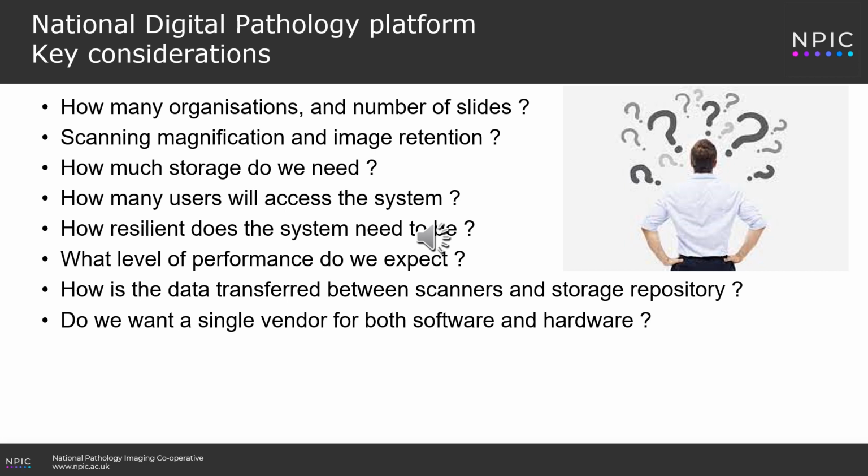Single vendor or multiple vendors? We decided to appoint a software vendor for the PACS solution and a separate infrastructure vendor. We felt it provided us with more options and flexibility, as well as potential longer-term savings.